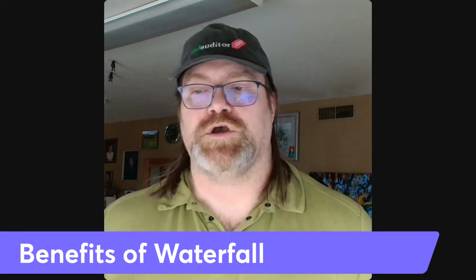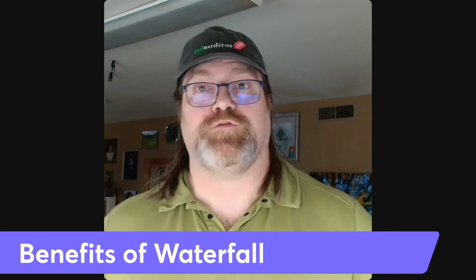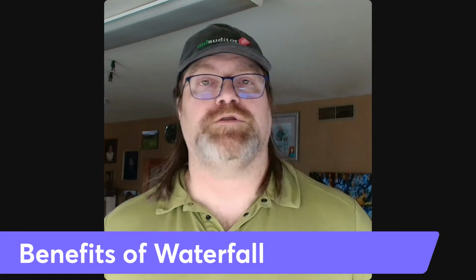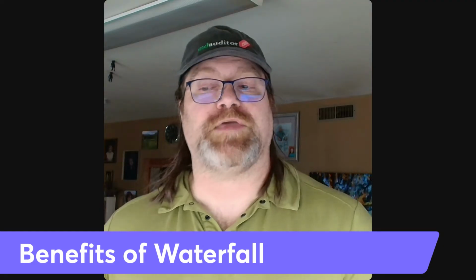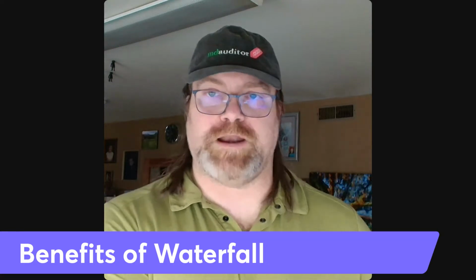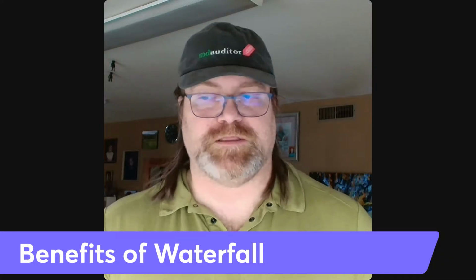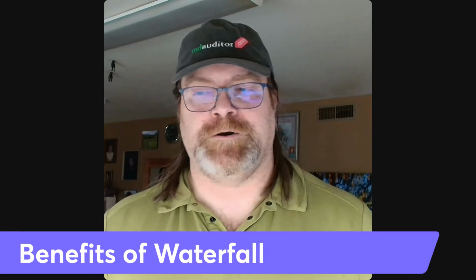Okay, so I have here benefits of Agile, but I should probably also be talking about benefits of Waterfall. So, well suited for less complex and well-defined projects. If you have a large system with a mobile app and a cloud piece and firmware on a mobile device, and you have all these different components and it's complex and it's doing multiple functions, that might be more appropriate for the Agile method. When you have a less complex system where you have well-defined requirements right up front, maybe that's better for a Waterfall approach. And you can afford to have very specialized team members and hand it off to the next group, because you're not going to make a lot of changes. You're not going to have any surprises.